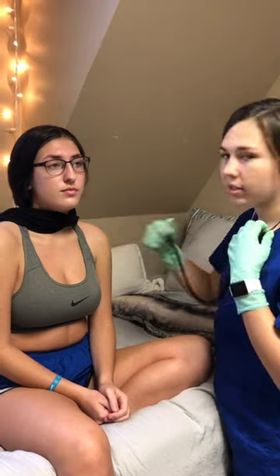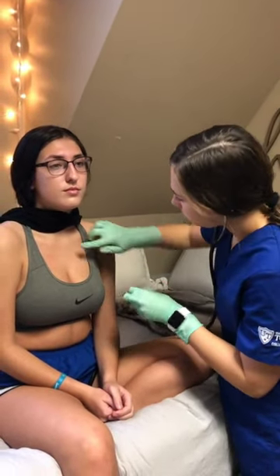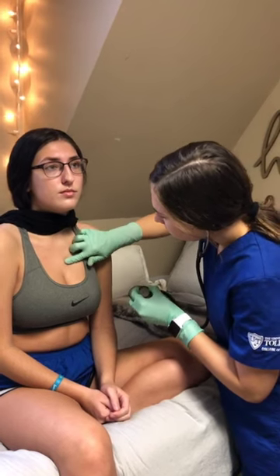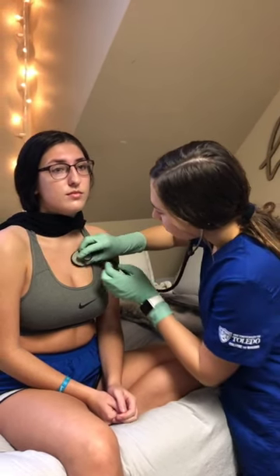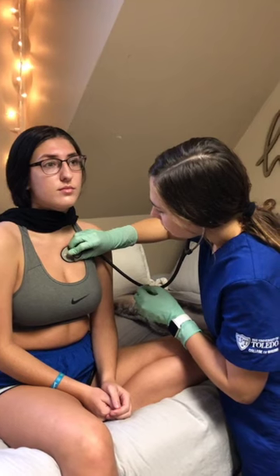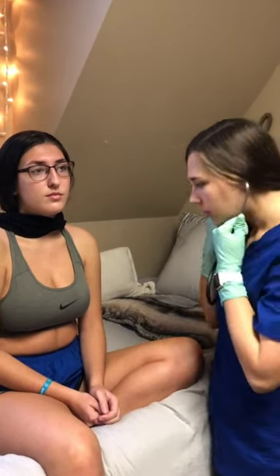Next I'm going to move to the pulmonic, which is the second left intercostal space. Next I'm going to be moving to Erb's Point, which is the second pulmonic area, third left intercostal space.